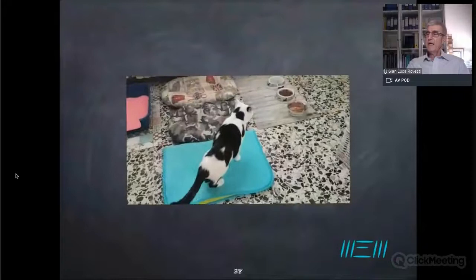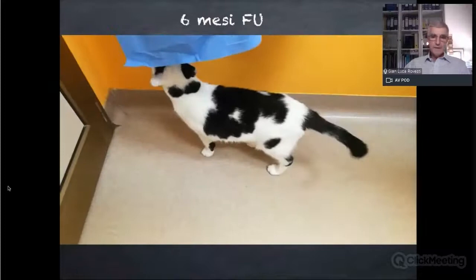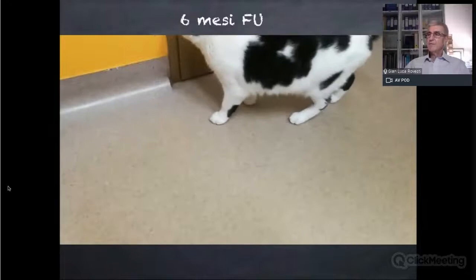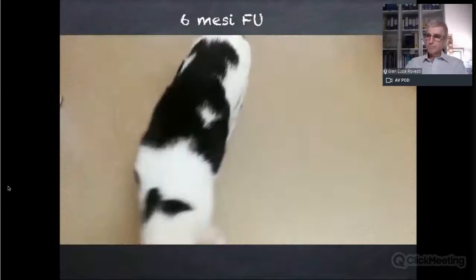And this is the 6 month follow-up. At 6 months, we are very happy because the cat is completely clinically normal. So this is, from the clinical point of view, a very, very good result, because the cat was walking and running, etc., in a full way, okay? Clinically indistinguishable from a normal patient, okay? And very simple fixator.